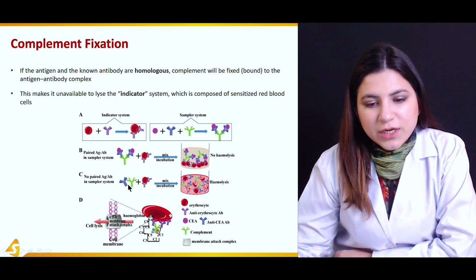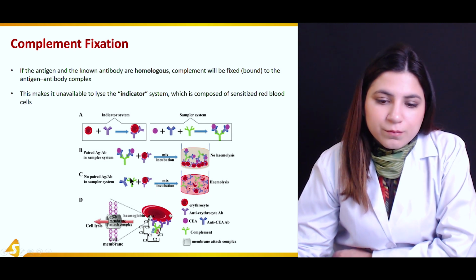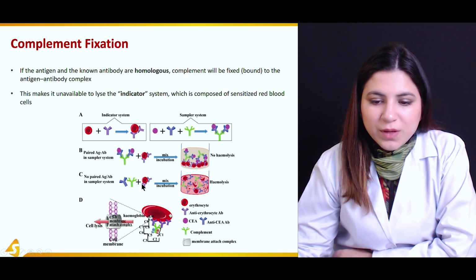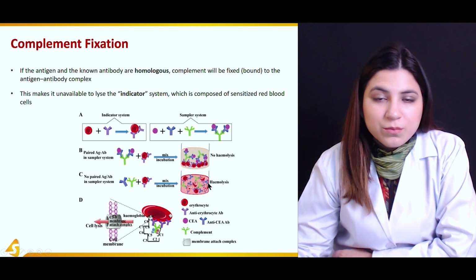If the antigen and antibody are not complementary or not bound, that is, they're not homologous, and then they are mixed and incubated with the indicator system, then these sensitized red blood cells will be able to lyse, and thus hemolysis will occur, and this can be visualized.